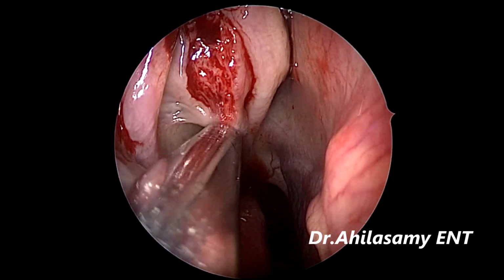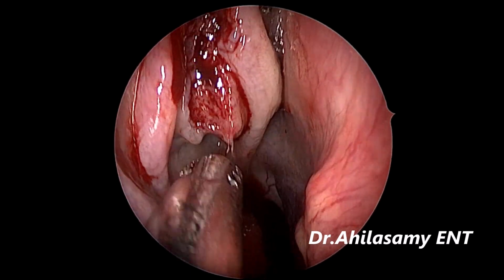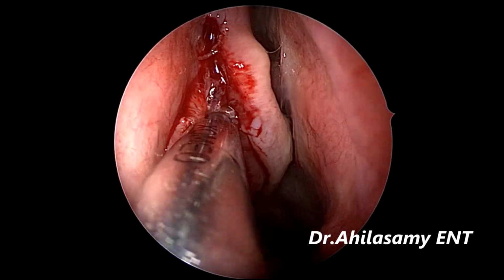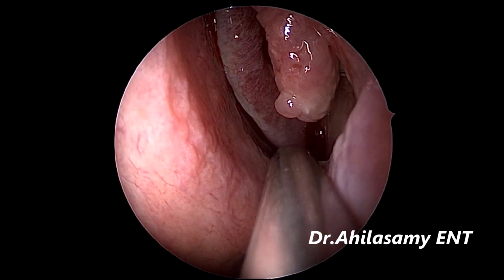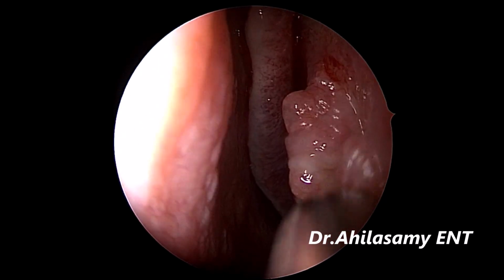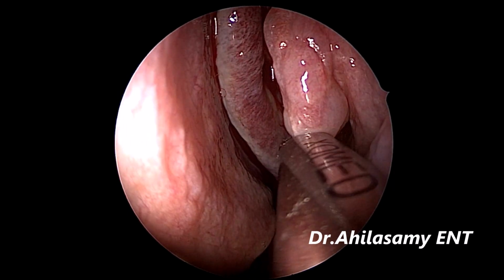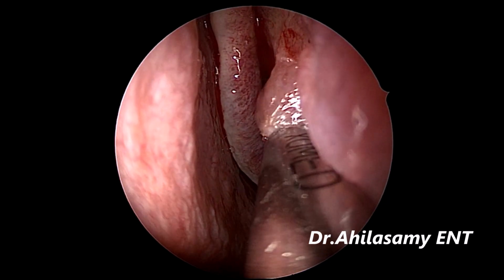Now I am getting the anatomy. That's a bulla. Polyps over the bulla have been shaved. You can appreciate the quality of field under local anesthesia, which you don't get in general anesthesia. This is the left side I am showing. There are also polyps. That also I am shaving to get an anatomy before I start the FESS surgery.